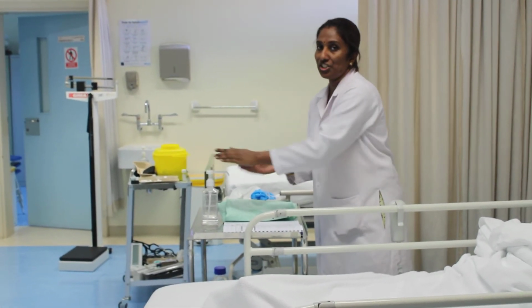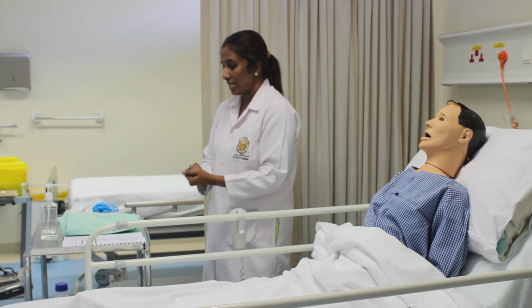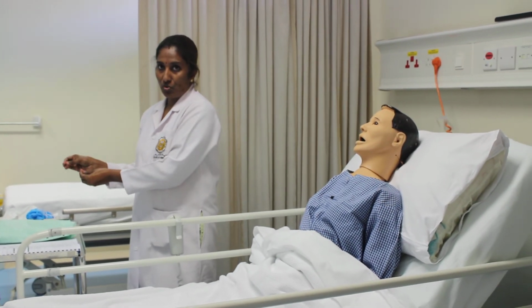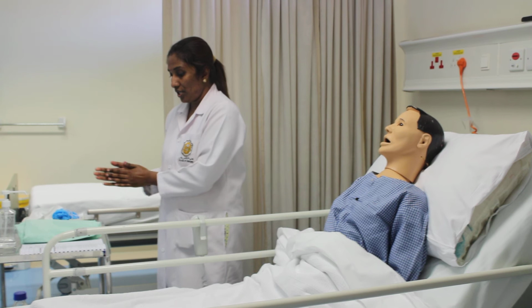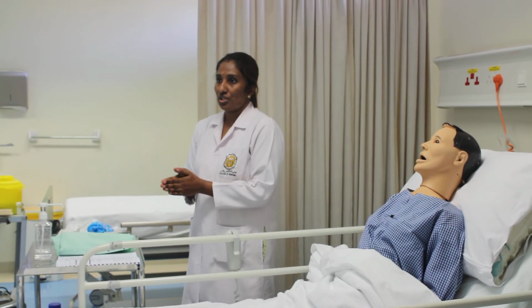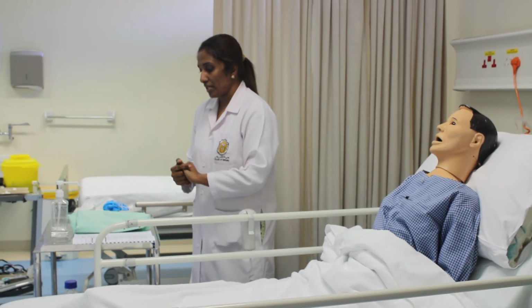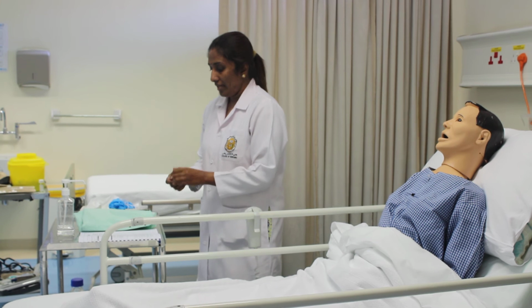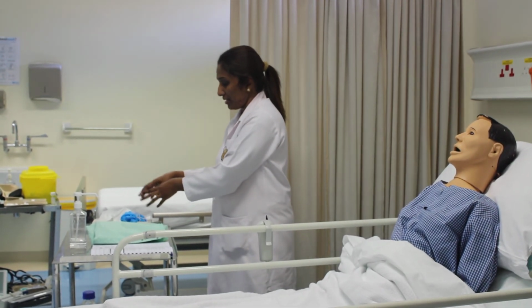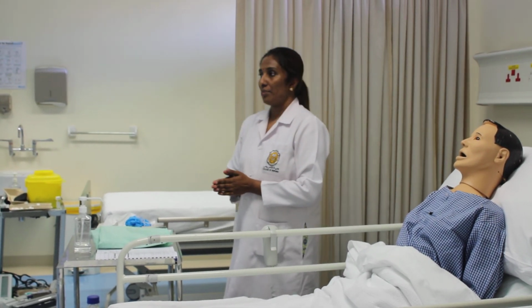You will be proceeding with your documentation of removal of the NG tube. If there was any gastric content or anything which you notice which is removed, that has to be recorded in your document. If the patient is comfortable, and there is no nausea or vomiting, you will record all this in your chart, and you will discard all those which you have collected, the tube and the gloves, whatever you have used, in the yellow bin. That's about the procedure.